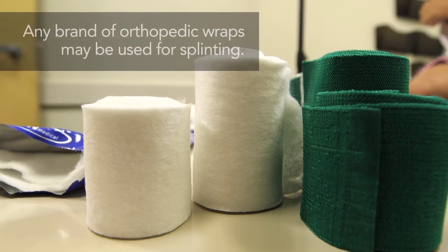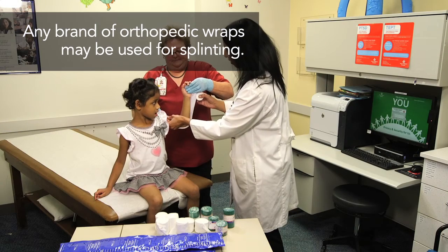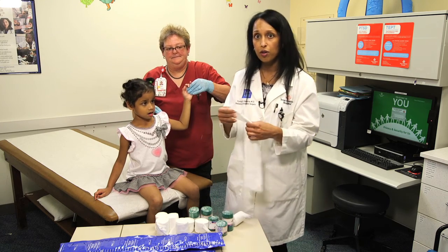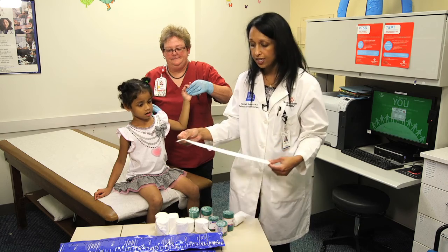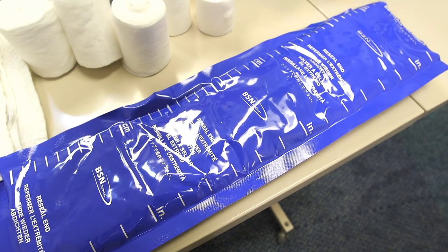I typically take web roll, which is a soft cotton liner, and measure from above and below the injury. Once you have a rough measurement, you're going to take that and cut your splinting material to the appropriate size. We use a material that has ortho glass with a nice layer of lining over the top of it.